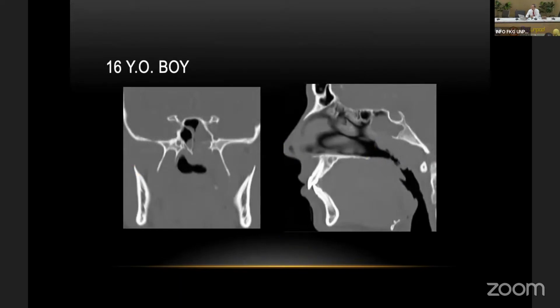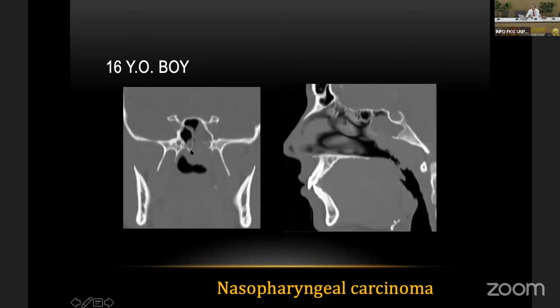And this is kind of an unfortunate patient, a 16-year-old boy. Certainly we did not expect these findings. You see bone destruction in the sphenoid sinus, and you can see here the floor of the sphenoid sinus is destroyed with a soft tissue mass inside the sinus.